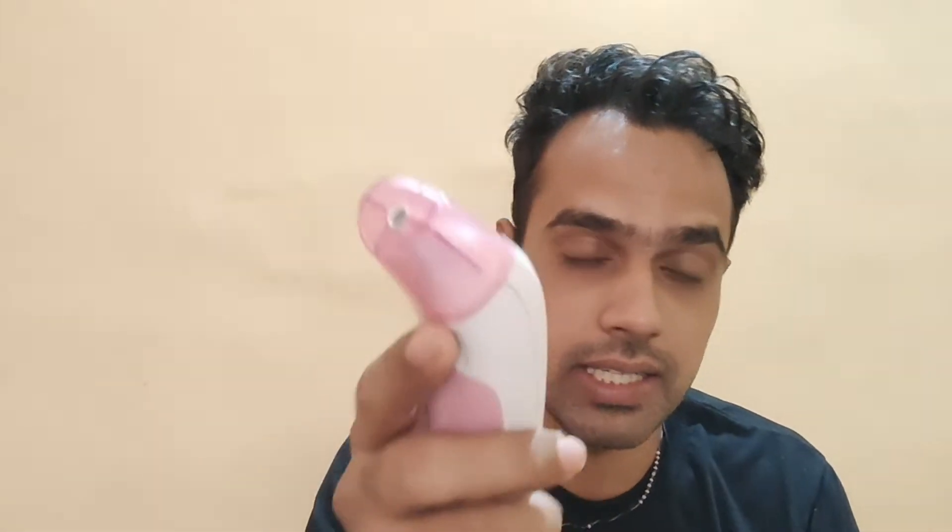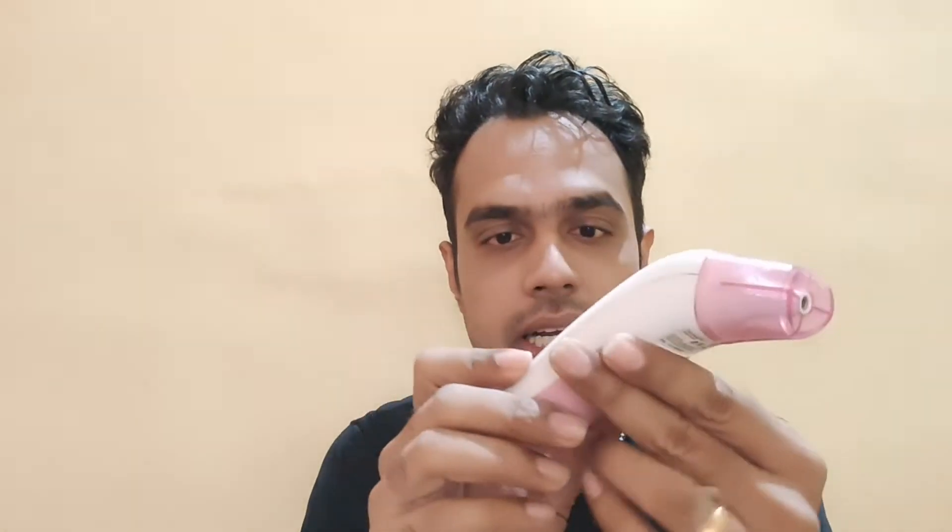This is the BPL infrared thermometer — it is called the BPL AcuDigit, as you can see written here. It's a thermometer with dual mode; basically it has a forehead mode and an ear mode, so there are two ways you can take temperature with this thermometer.